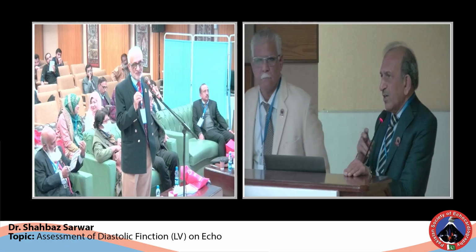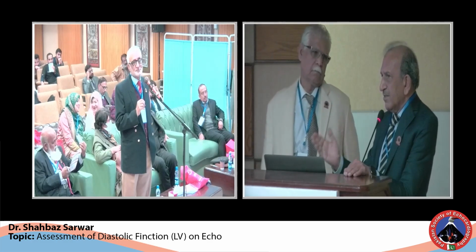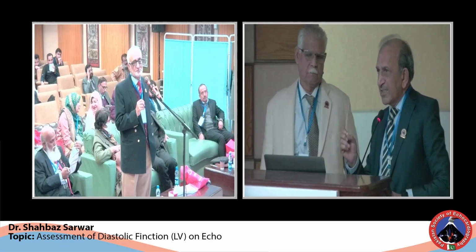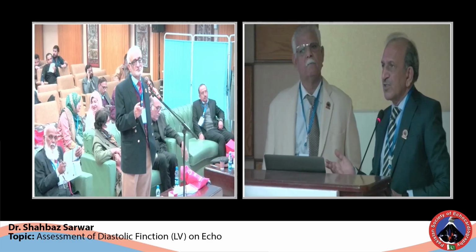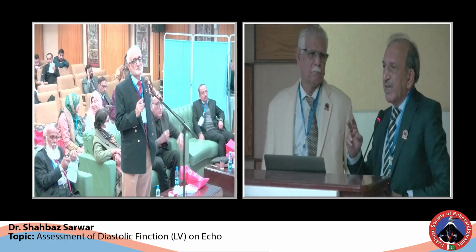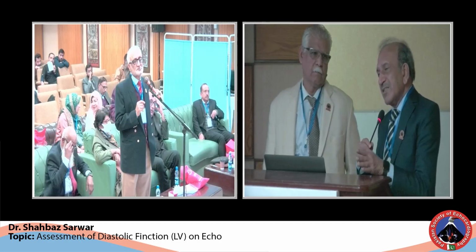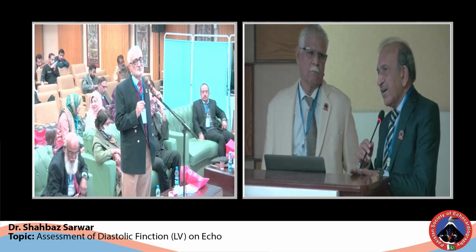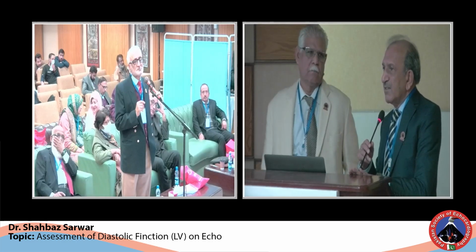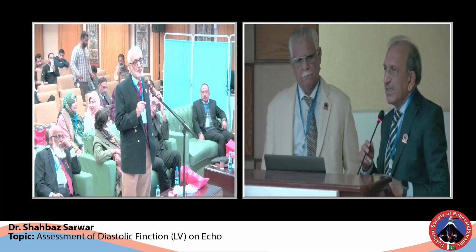Absolutely right. Doing a modified stress test in our kind of situations, just raising the legs and doing it properly, is very, very helpful, especially in those patients who are dyspneic but things look normal. And atrial fibrillation, the toughest area, defining diastology. I totally agree. We have to do these things.